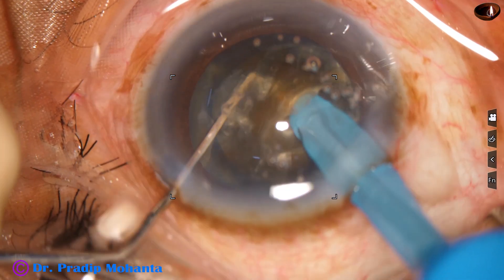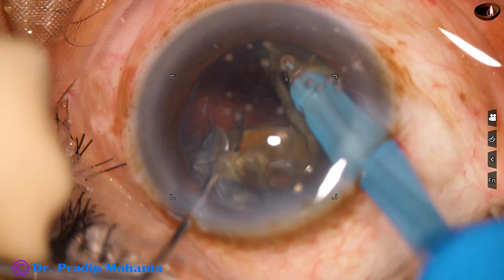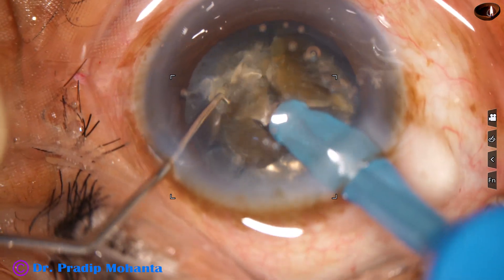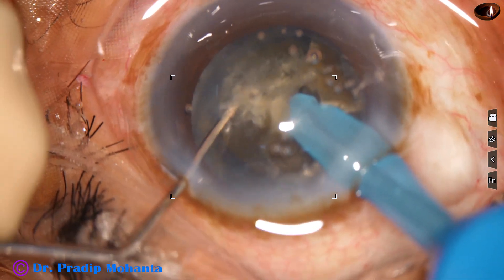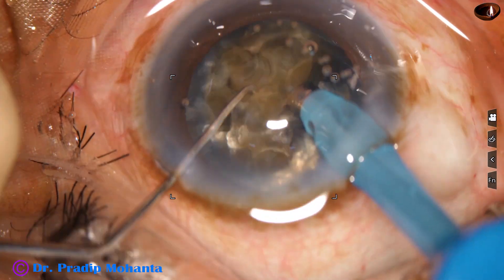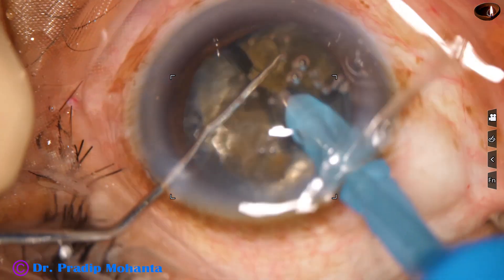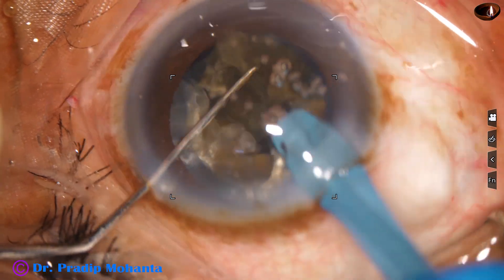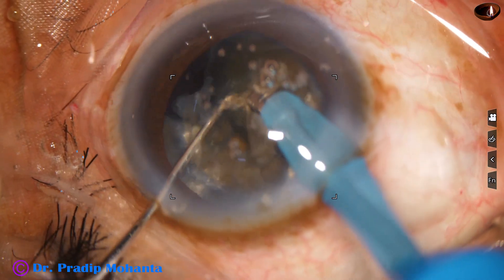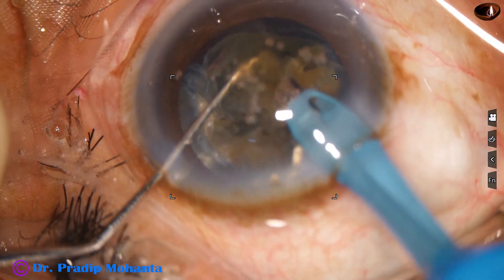The heminucleus is held with vacuum and a complete separation of the two heminuclei is achieved. This is the larger heminucleus, and I am going to divide it into three fragments. I come to the larger piece, hold it very firmly, and chop it. These three fragments are then emulsified. I am in phaco 2 mode from the very beginning, where vacuum is 450 mmHg.